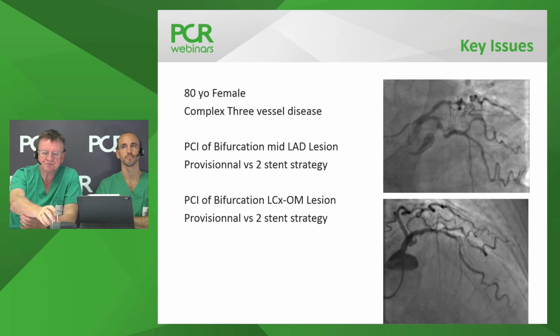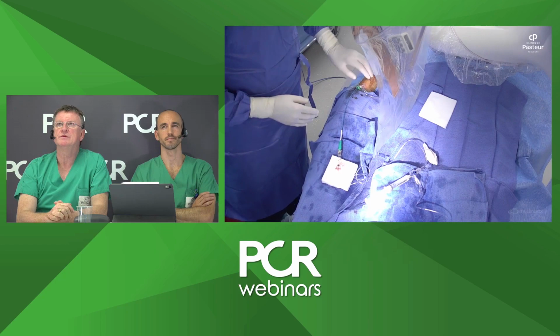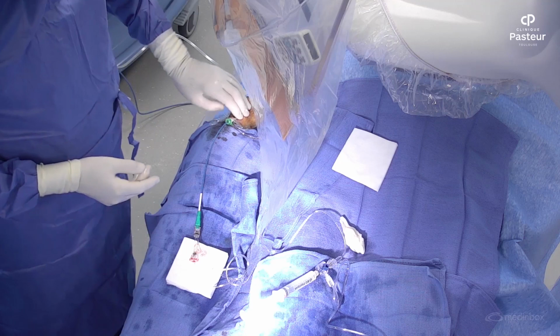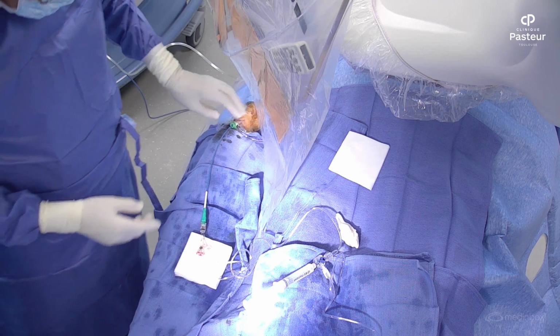We have already placed a six French Glidesheath Slender on the right radial artery. This woman has a nice radial artery. Here we have a six French XB 3.5 guiding catheter, and here we have already performed some views.